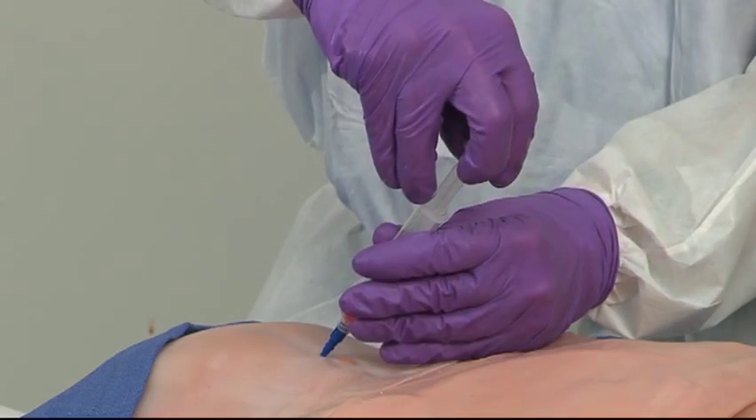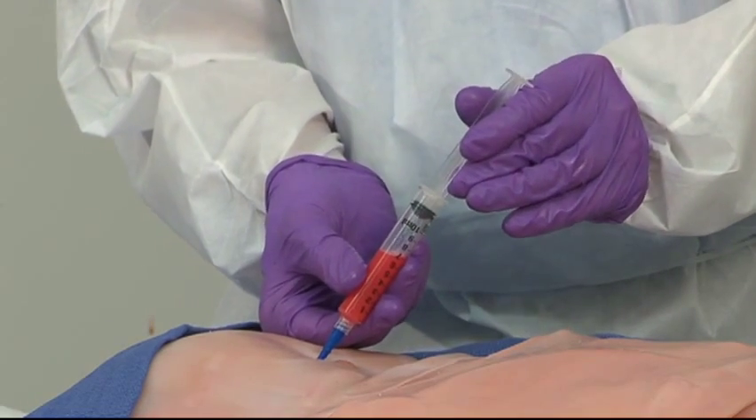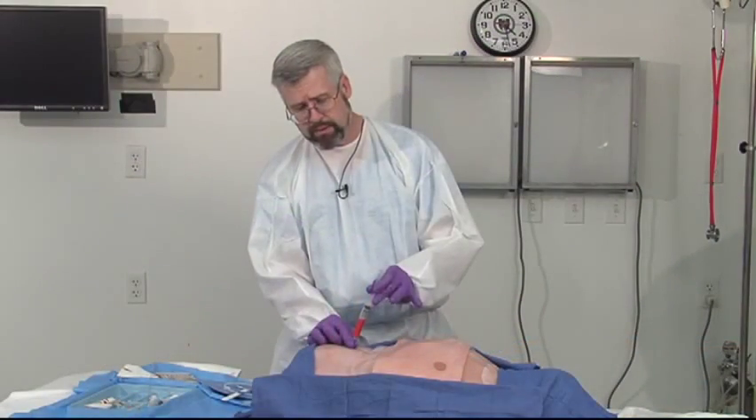I'm aspirating and I'm getting out blood. You can see I have about eight cc's of blood that's come out of this tap. This constitutes a positive tap and this patient needs an exploratory laparotomy.